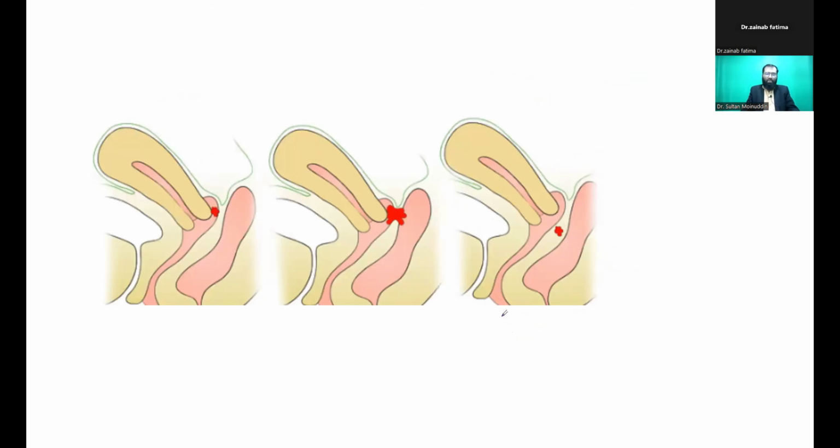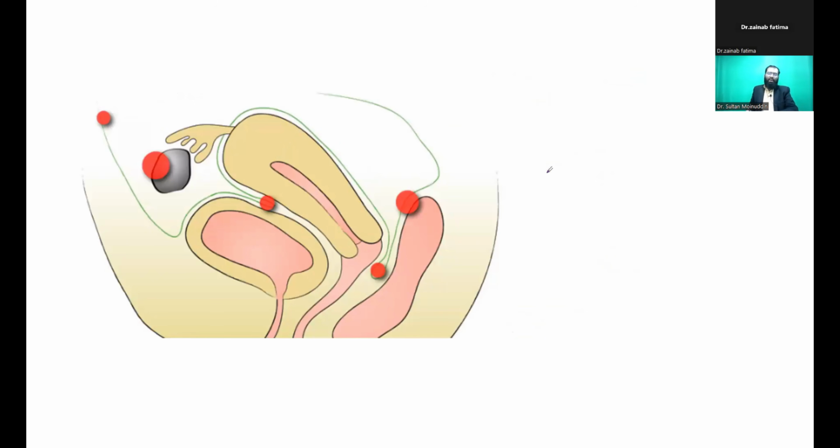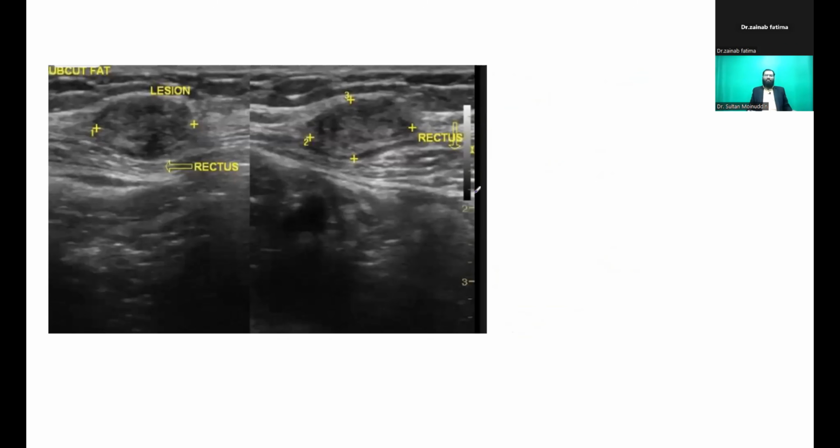Okay. So this is how you can see endometrial tissue most commonly in POD or in ovary, which can be painful. Okay. Now this is an interesting case where which probe have we used? This is a linear probe. Okay. Or SP probe. Here you are able to see the rectus sheath.